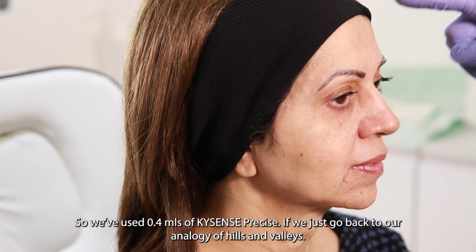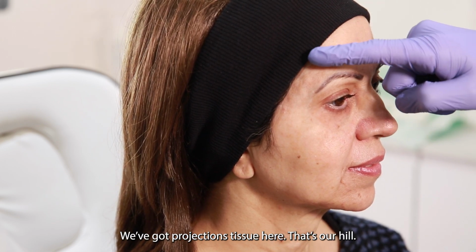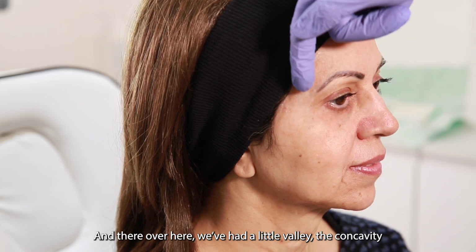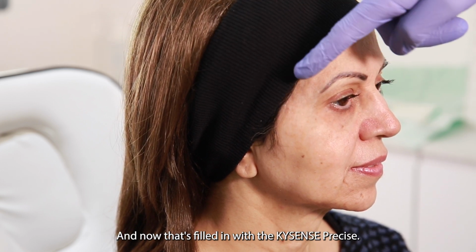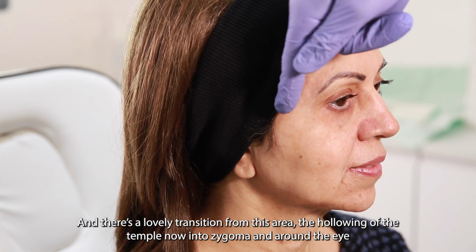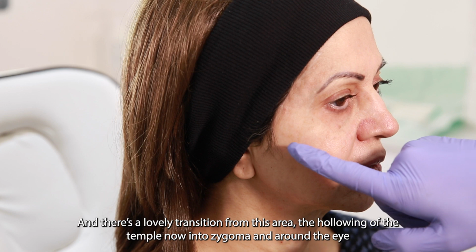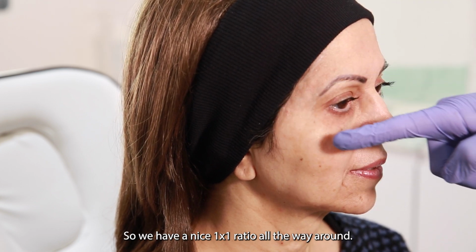If we just go back to our analogy of hills and valleys, we've got projection of tissue here, that's our hill. And then here we had a little valley, the concavity, and that's now being filled in with the KYSENSE Precise. And there's a lovely transition from this area, the hollowing of the temple, now into the zygoma and around the eye. So we have a nice 1-to-1 ratio all the way around.